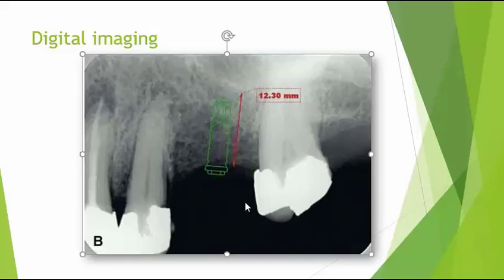In this slide, we are measuring if we have sufficient remaining bone to do an implant. This is the maxillary sinus floor, and here we have an implant. The remaining bone is sufficient according to the measurement, and we are determining the best alignment for the dental implant.